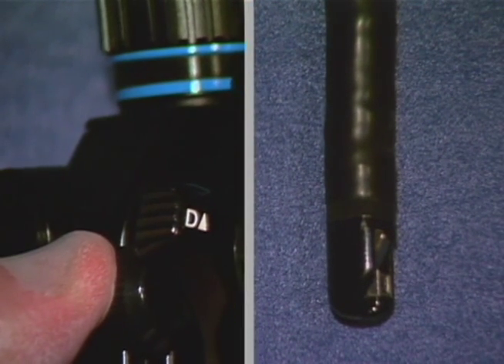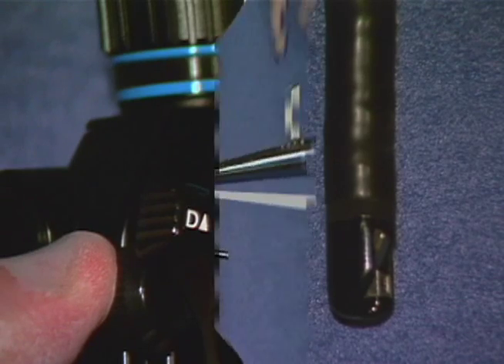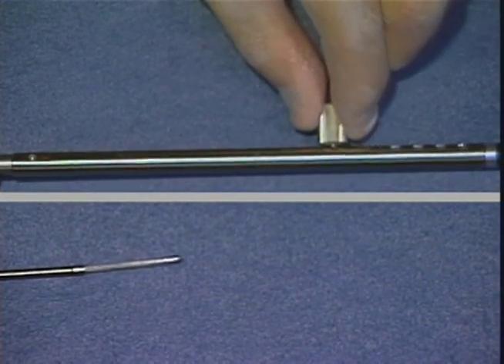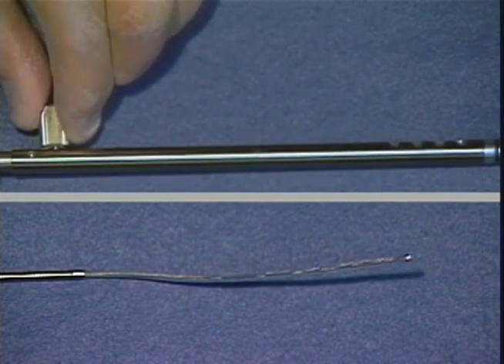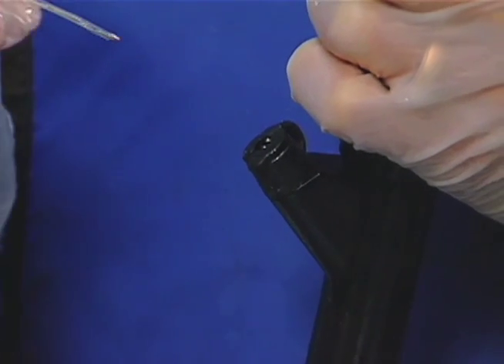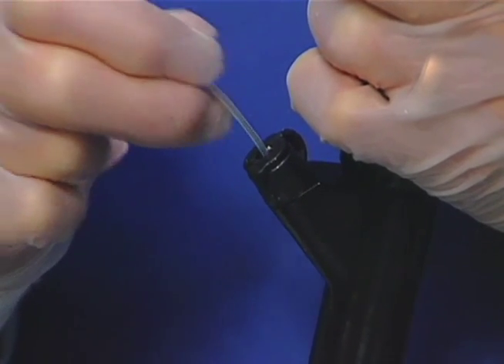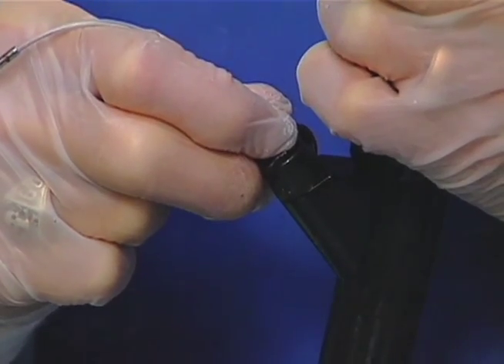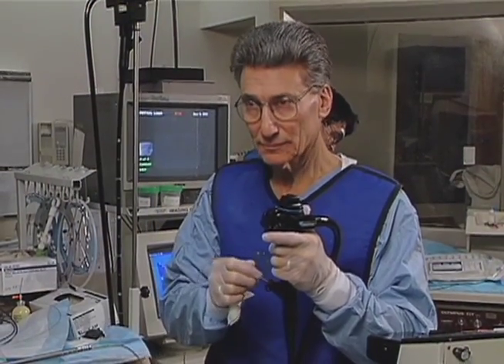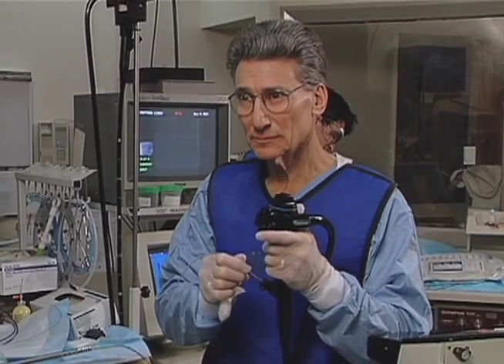Fully raise the forceps elevator of the endoscope. Loosen the knob of the slide region on the coil sheath, slide it as far towards the proximal end as it will go, and then secure it by tightening the knob. While observing, carefully insert the lithotriptor into the instrument channel with the basket in a completely closed position until the basket tip hits the forceps elevator.